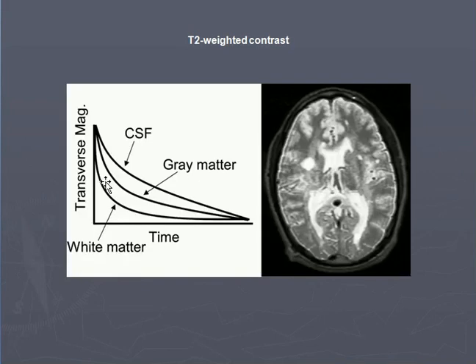Now this is T2 weighted image, the total contrast opposite of the T1 weighted image. Here the CSF looks bright. So this is the main difference between the T1 and T2 weighted images, where fluid looks dark or low intensity in T1 weighted image and bright or hyperintense on T2 weighted images. These are the basic phenomena which occur in T1 and T2 weighted images.